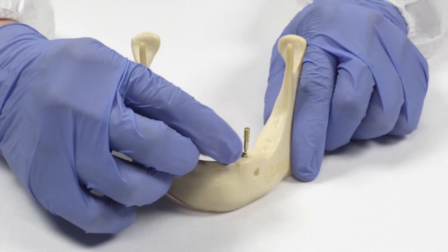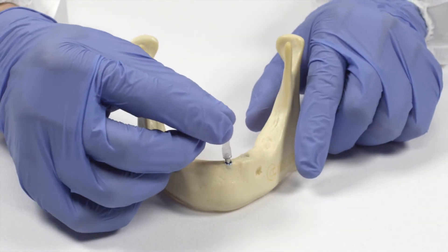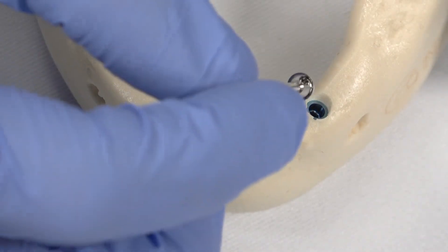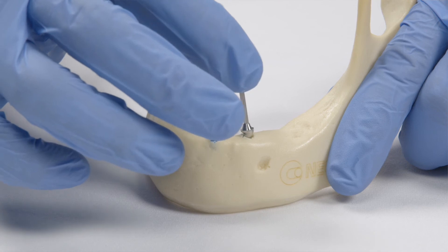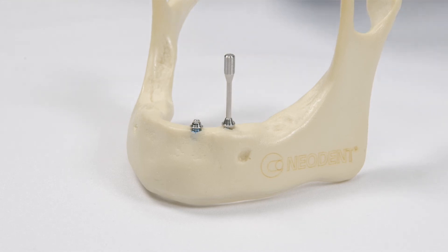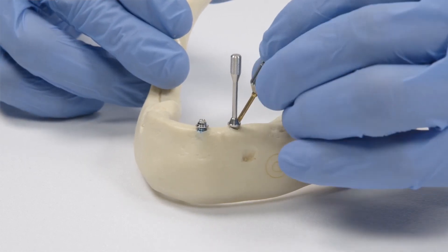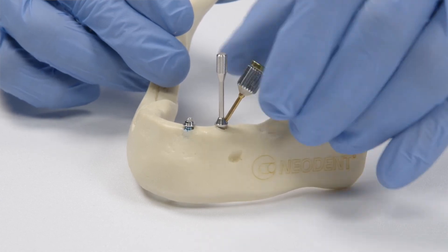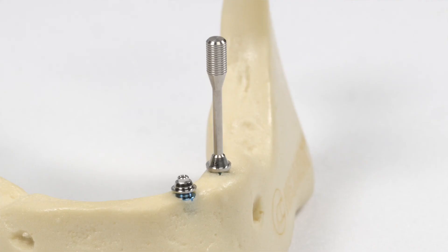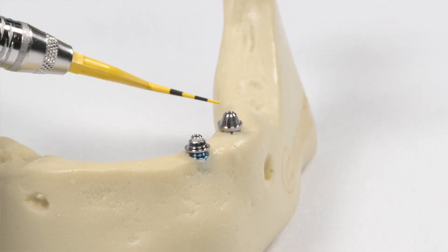Next, take those pins out and put a straight mini conical abutment in the more anterior implant, and place the 30-degree mini conical abutment more distal. Now torque the angled abutment with the driver to 20 Newtons manually. After removing this, here are the two mini conical abutments parallel now.